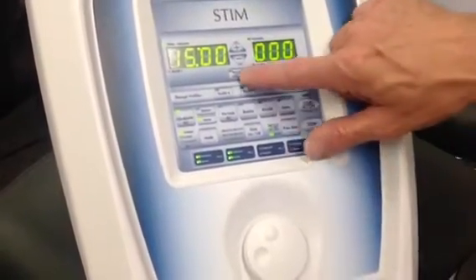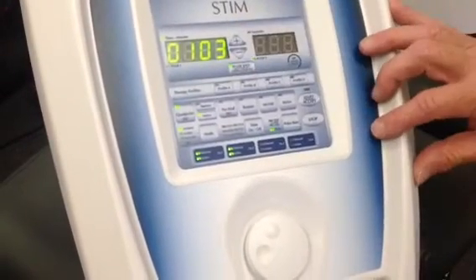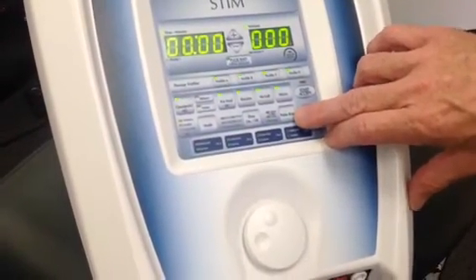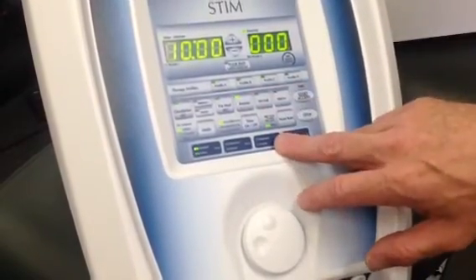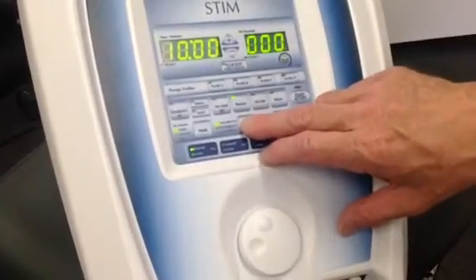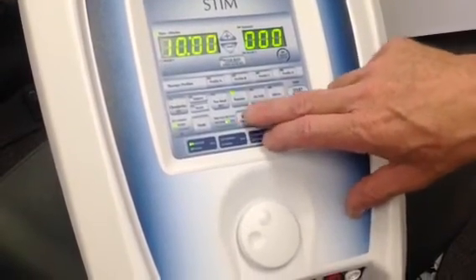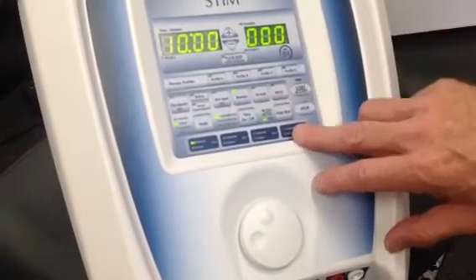And then you can have a fixed rate where you push your pulse rate and you can make that fixed rate whatever you want, completely consistent all the way through the treatment. All right? So that's your pulse rate button, and then your time on, time off button. Okay, that's only relevant when you actually have on and off times, like in Russian stim. You have a 10 on, 30 off. You have a 10 on, 20 off, a 10 on, 10 off, 5 on, 10 off, and a 5 on, 3 off. I think the first one was 10 on, 50 off.